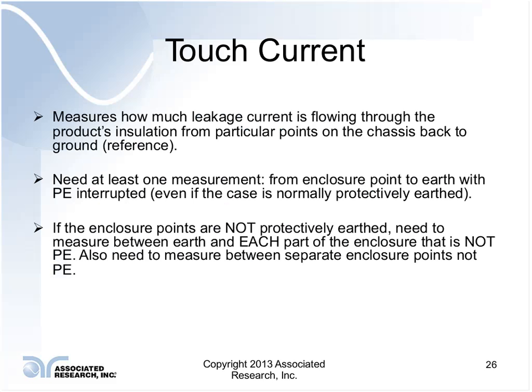That's kind of the case I mentioned before. If you have various chassis points that are not protectively earthed or not grounded, you've got to measure from point to point as well as from each point back to your reference, to make sure that those insulation barriers don't have too much leakage current flowing through them.